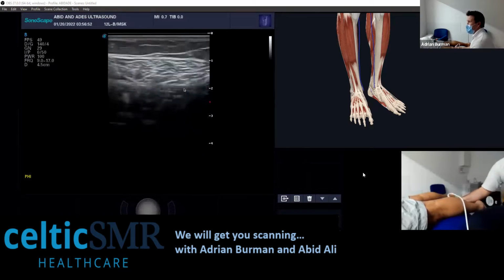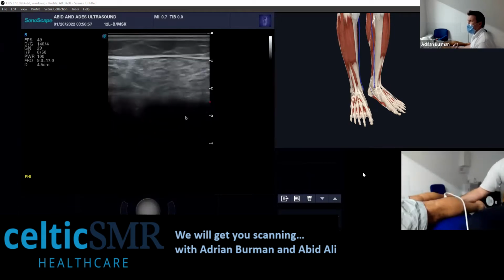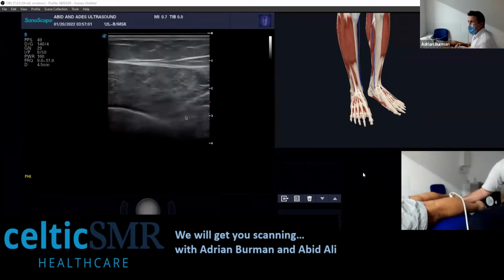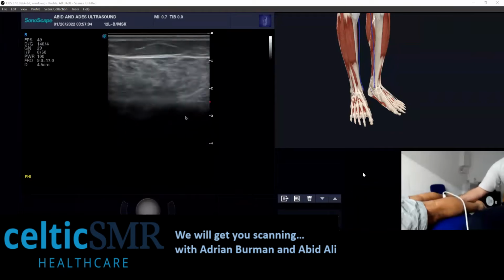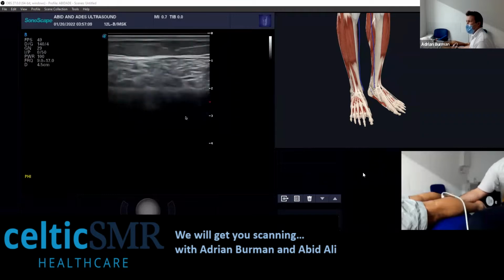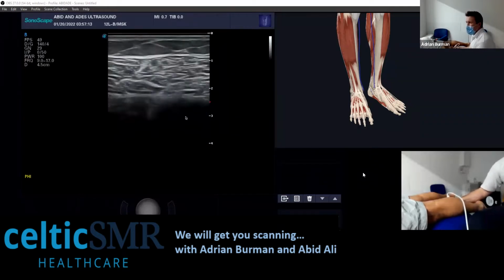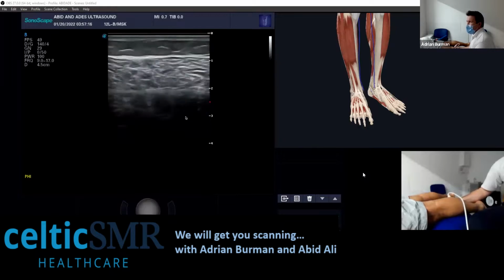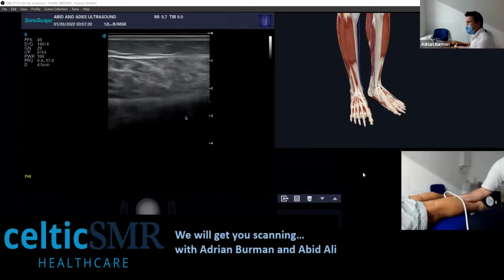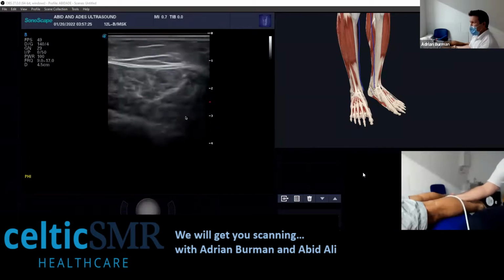Another good tip is, if you run through the muscle quite quickly, then focal areas will jump out at you. So if you're running through it quite quickly and you come across a scarred area, a little nodule will pop out easier for you than if you're just going through it slowly. So you can do this to start with, just to get your eye in, and then interrogate it a bit more if you see something jump out at you. That's what I'd do. But that's brilliant.